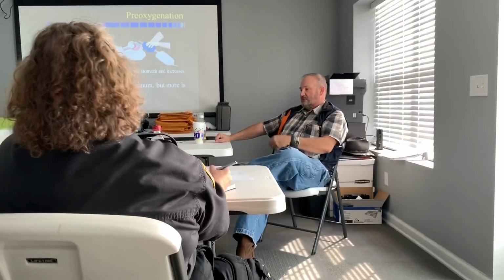If you've got extra people in there with you, people that aren't used to this, make sure they understand what's going on. I'm fixing to give him some drugs. He's gonna stop breathing. We're gonna breathe for him, and we're gonna take care of his airway. Rather than we give the drugs and then somebody's going, well, he's not breathing, oh, well, we know that. This is what we want. So let them know up front. For example, if you've got firefighters or somebody else that's not in tune with what we're doing or not trained to understand what you're doing, make sure that they understand it so they won't freak out.